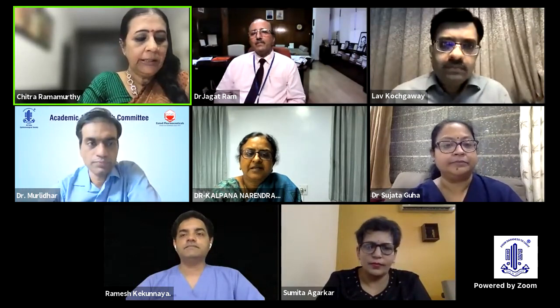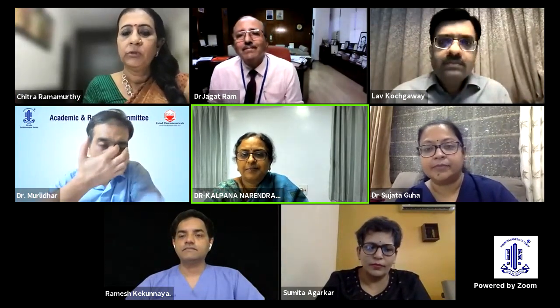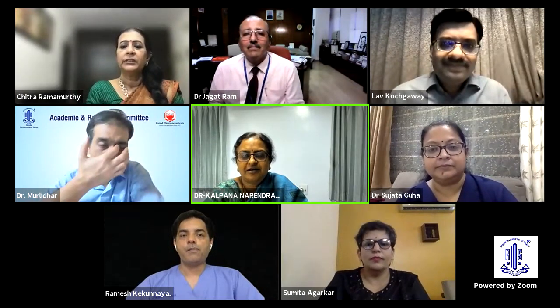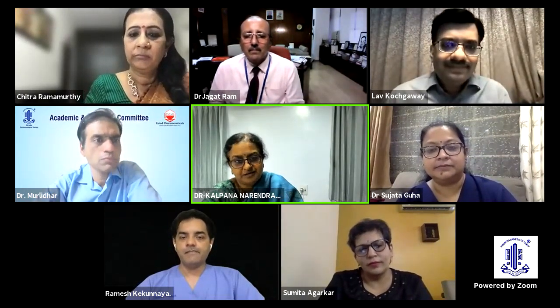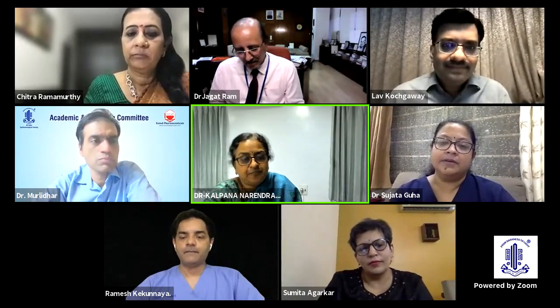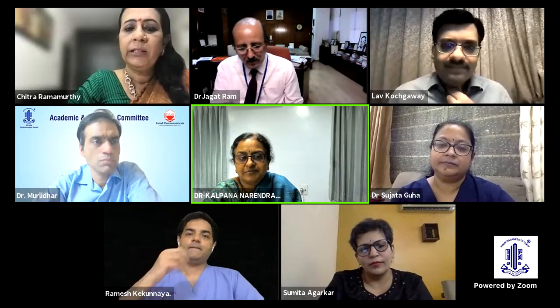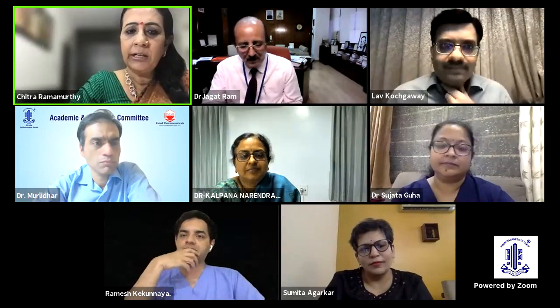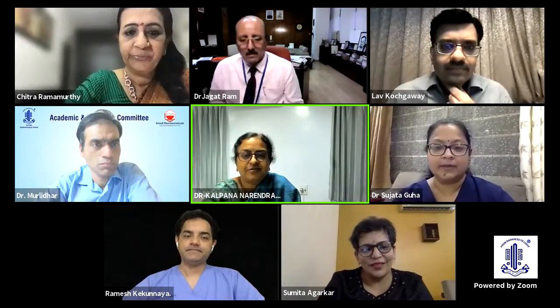Thank you. There's just one point. There's one lens which is popularized by Marie Tressignan. That's a very special lens where she does this optic capture. She claims in Europe it's been showing good results, but we have no personal experience. I think those IOLs are not available in our country, are they? No, they're not available. I mean, you can source it if you want, but.